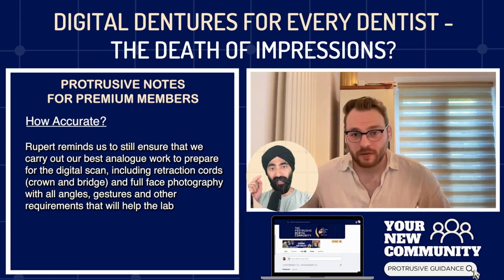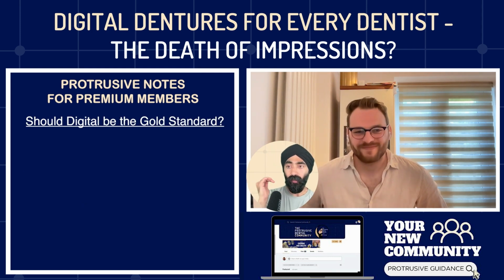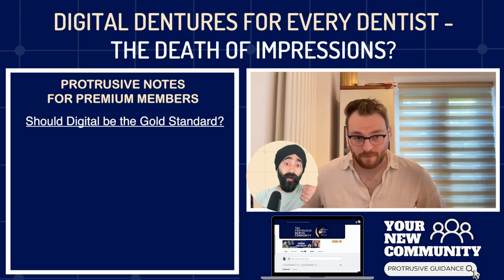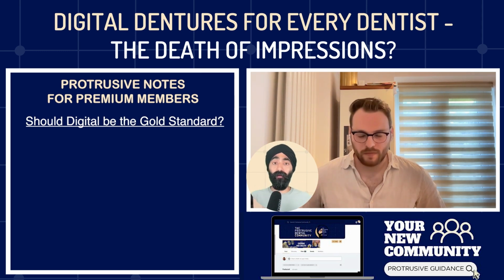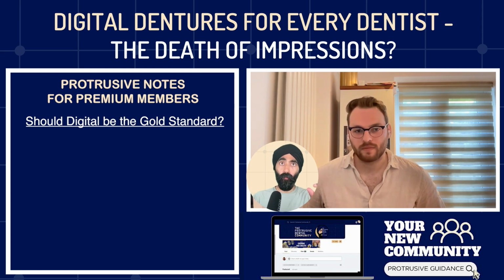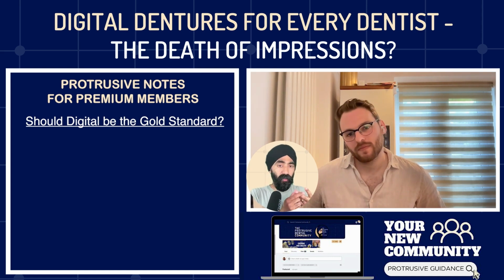So my next question really is, now that you did this little experiment, which I highly respect, and you found that actually all this digital stuff we're doing is improving patient outcomes. So that's already one reason why we should, because for me, I'm thinking, look, you've done the impressions. To scan is actually an added step for the clinician, added time and step, right? And the quality of scan, what if something goes wrong, etc., etc. So we're actually adding time in some ways for the clinician to produce this digital result, but we're getting potentially a better result. Is it also cheaper? Is it also faster, better in other respects?